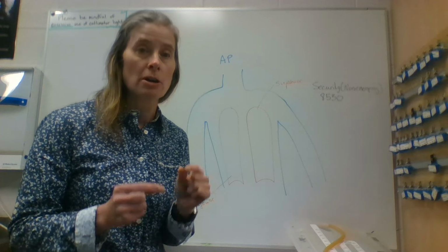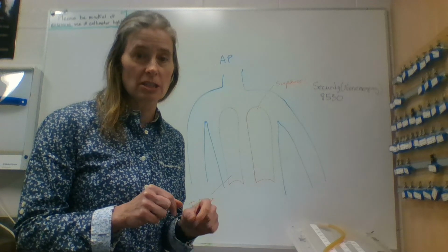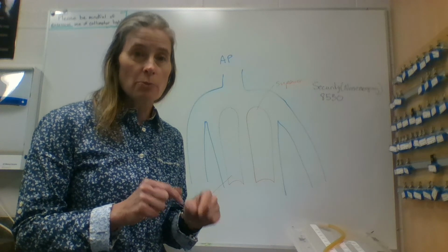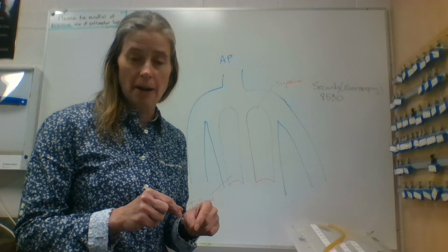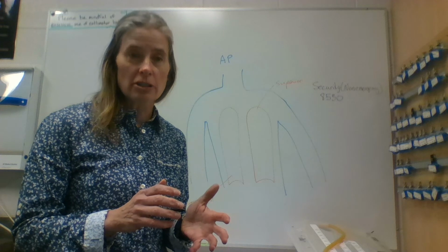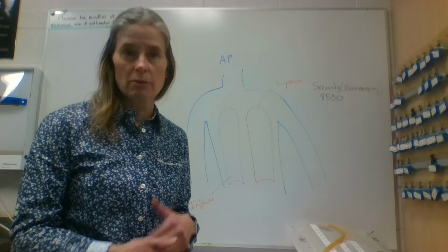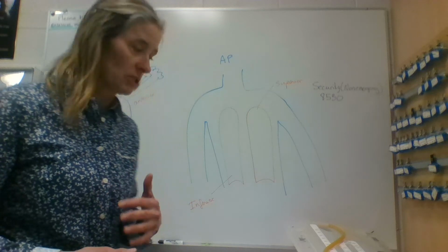but sometimes these things happen. So if a chest tube does have to be inserted into the patient in the diagnostic imaging department, the radiologist will be responsible for doing that, okay? Because we have to ensure that pleural pressure is reestablished, okay? Because if there's an injury, then the thoracic cavity pressure itself has been changed.